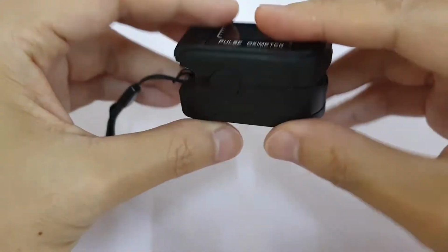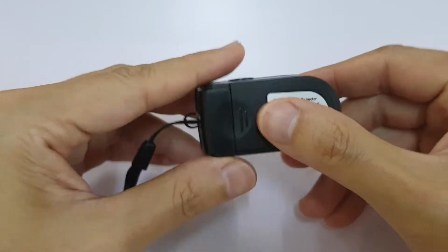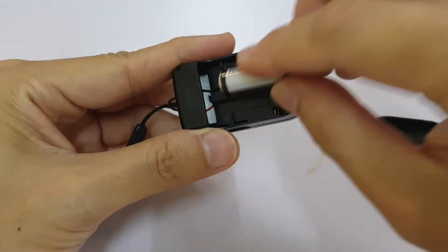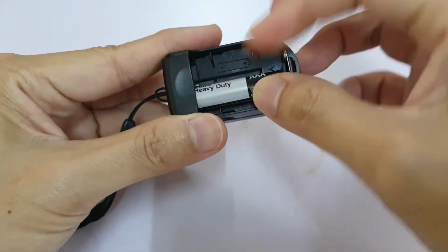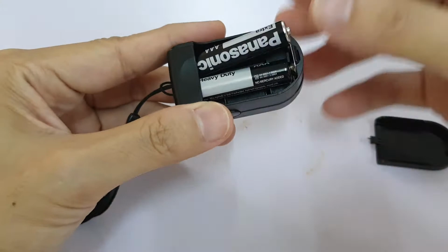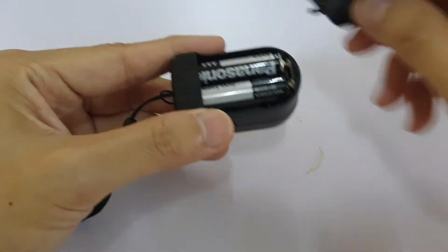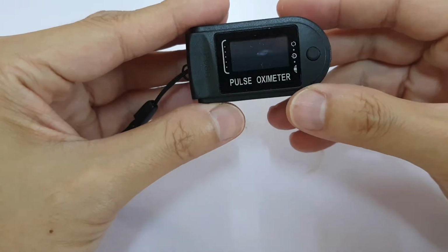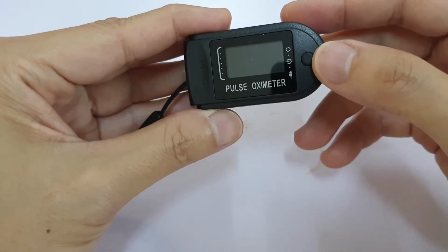Now most of these are built similarly. It runs on two AAA batteries. So let me put in the battery and then we will have a look at how it works. Make sure you have the polarity set correctly. Once you have the battery in, there's only one button to turn it on.